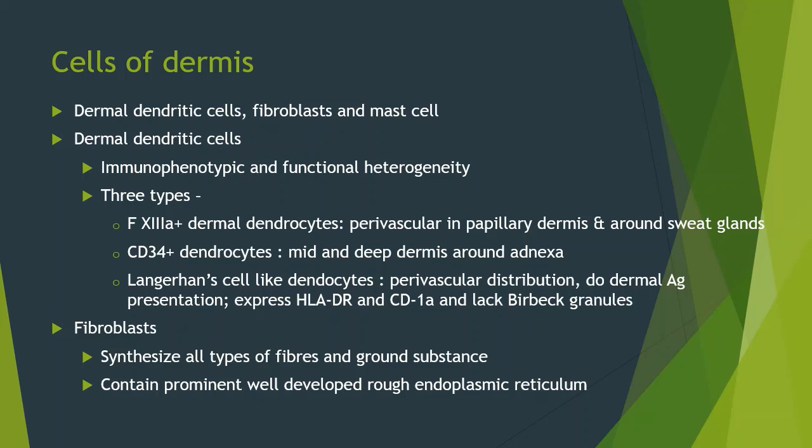Fibroblasts can also be present in the dermis. They synthesize all types of fibers and ground substance. They contain a prominent, well-developed endoplasmic reticulum in their cytoplasm.